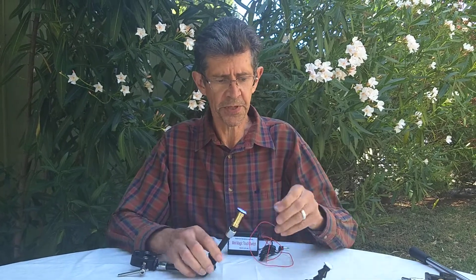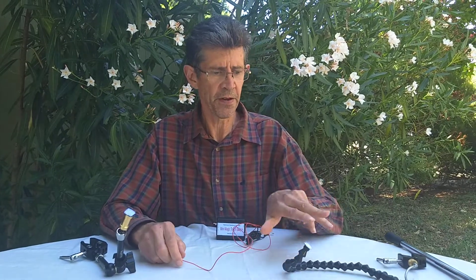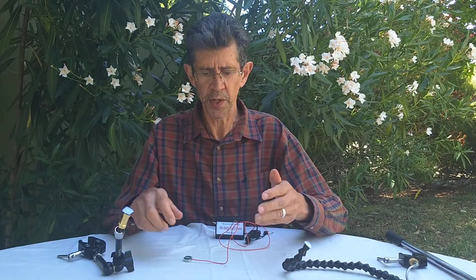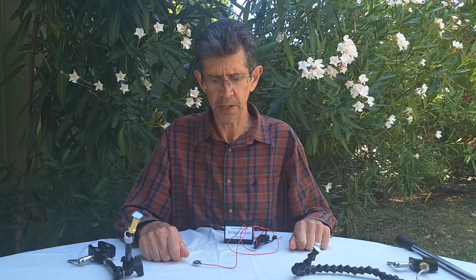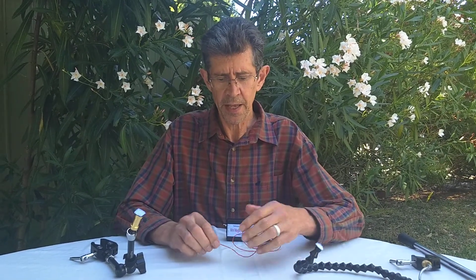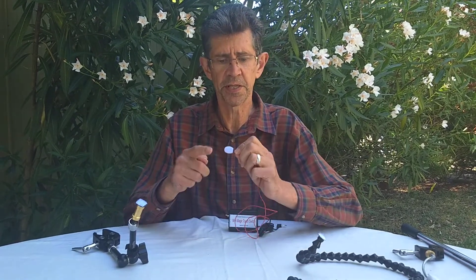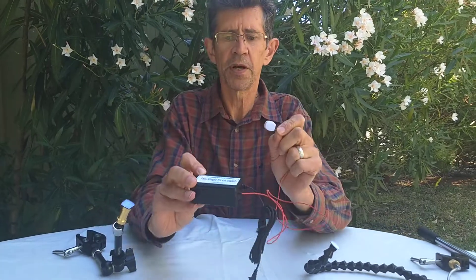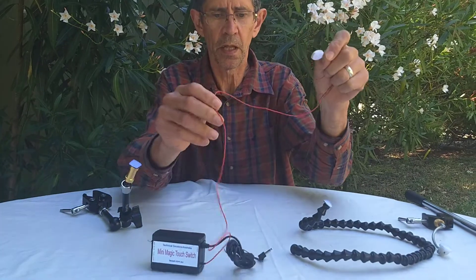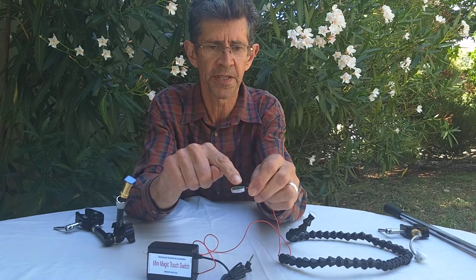So there are three mounting options we're selling straight off. If they're not going to suit you, be aware that we could use this with virtually any of our mounts that you see on our website — we've got a whole range. You're also welcome to devise your own mounting system since it's just got velcro on the back of the sensor. To remind you, it's the mini magic touch switch with a long thin lead and a tiny sensor on the end, and it is incredibly sensitive.